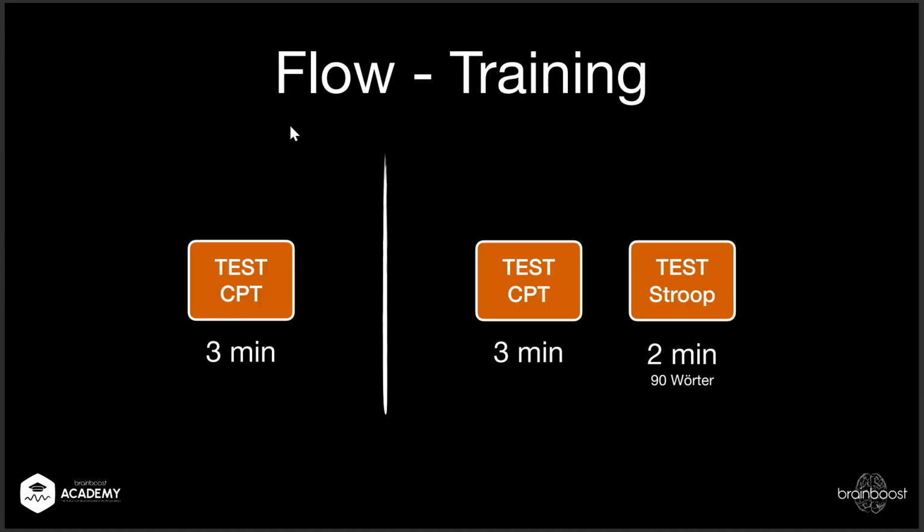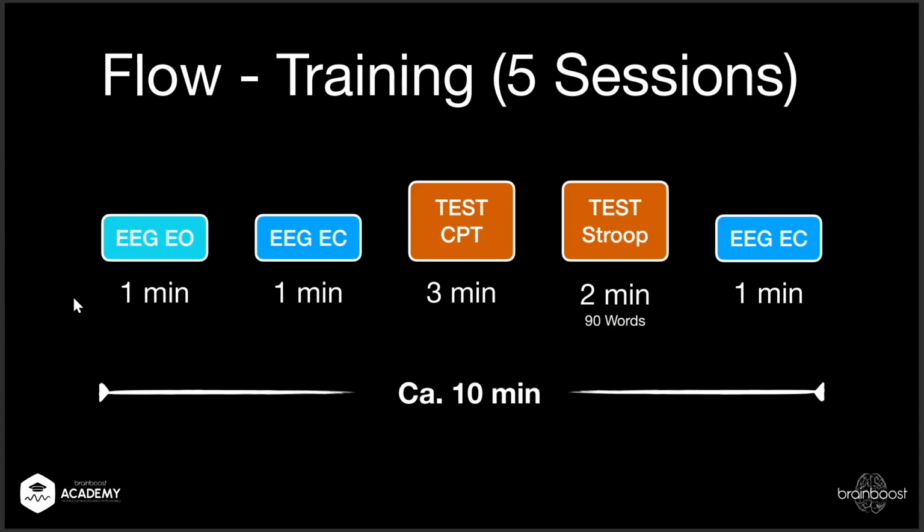If you say, you know what, I'm not really reading out EEGs in front of every session, because maybe it also creates some pressure on me that people say, you need to tell me what happened here, then just do a CPT test, maybe two tests one after another. You don't get better at a CPT test by learning it, because you learned it, just press when there's a circle. You get better with better reaction time, etc. So use a flow to maybe also just do a test.